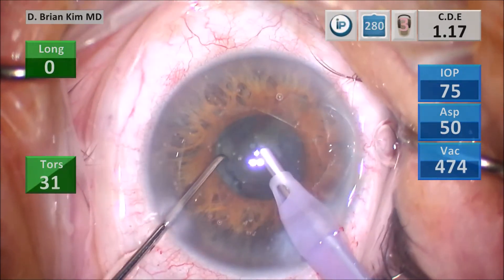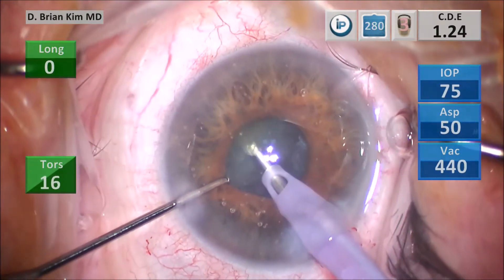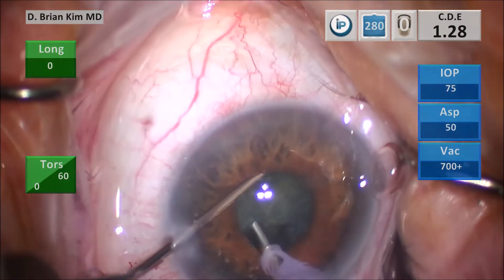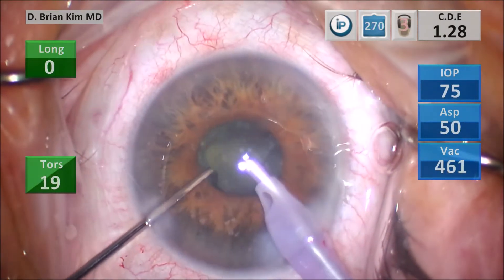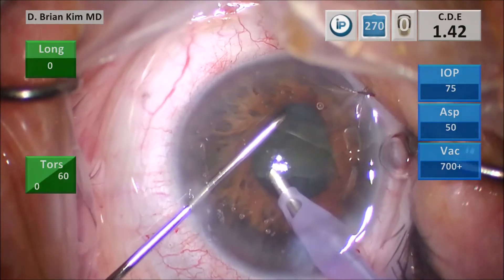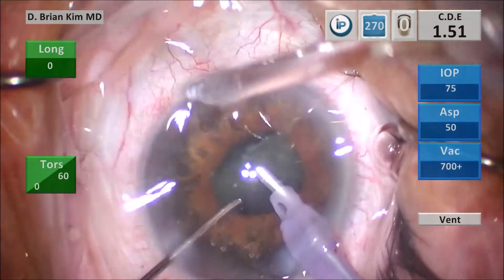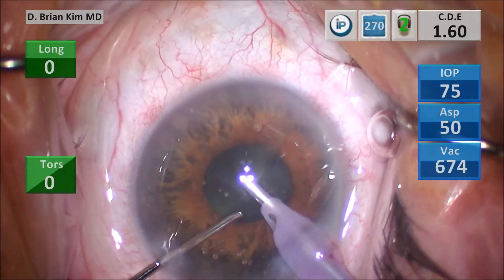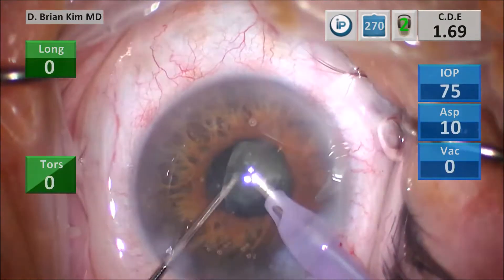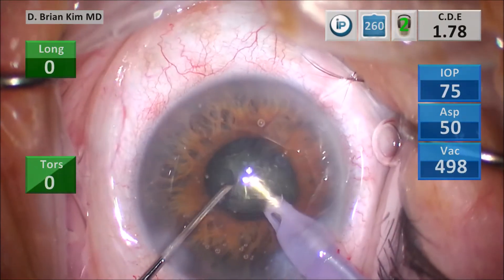Why do I prefer this versus using a ring or some other technique? First, this technique does not require a red reflex. With sculpting you need a red reflex to determine how deep you go, and when you have a small pupil there isn't a very good red reflex — so this technique is red reflex independent. Second, with traditional chop techniques you have to impale into the lens material and hold it with high vacuum before chopping. With such a small pupil, high vacuum might inadvertently grab the iris or another structure. By using mechanical forces only, you're not relying on high vacuum, which can be uncontrolled and grab something you don't want.